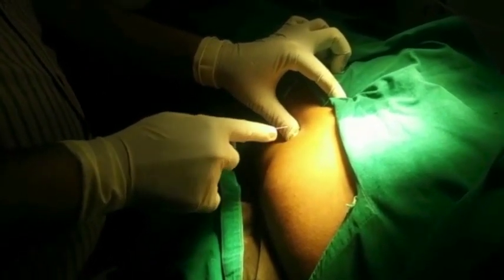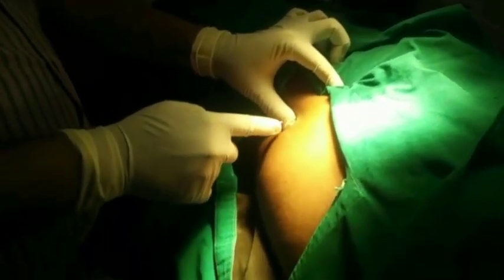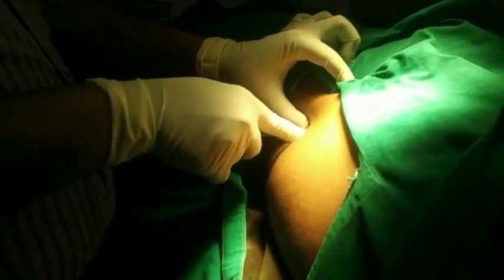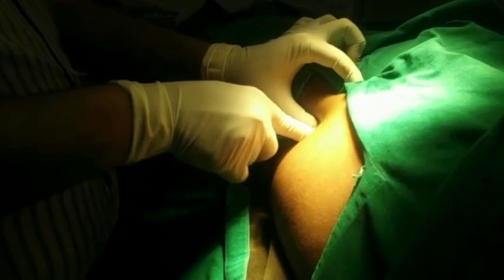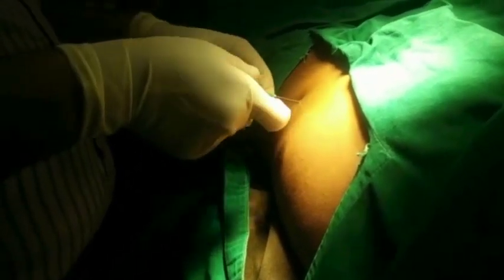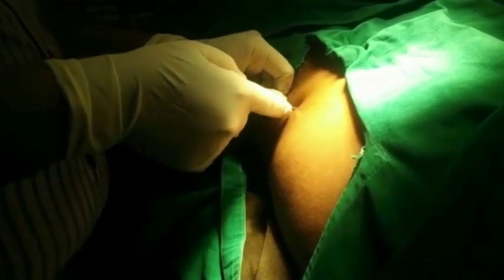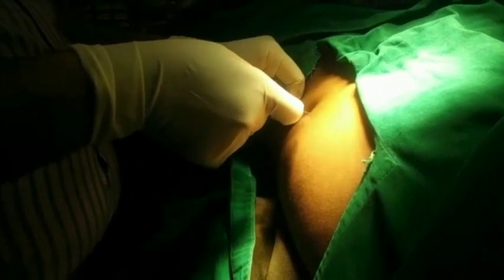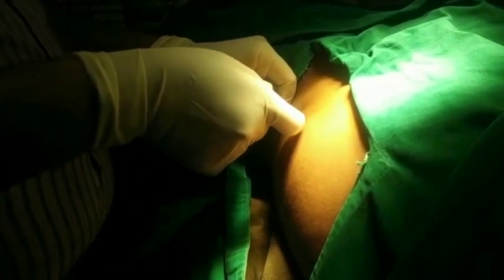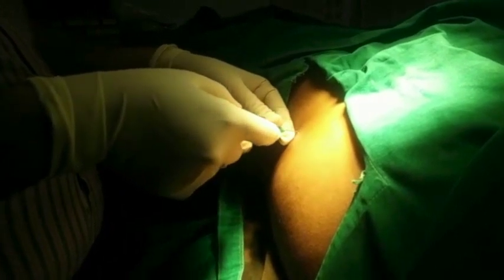Here you can see I am inserting the blunt tip needle. After painting and draping, I am inserting the needle through the skin. Here you can see I have kept the finger so that I don't go too deep. So now I am advancing the needle, feeling the bounce and pops of the fascia, first pop, and then feeling the second bounce.